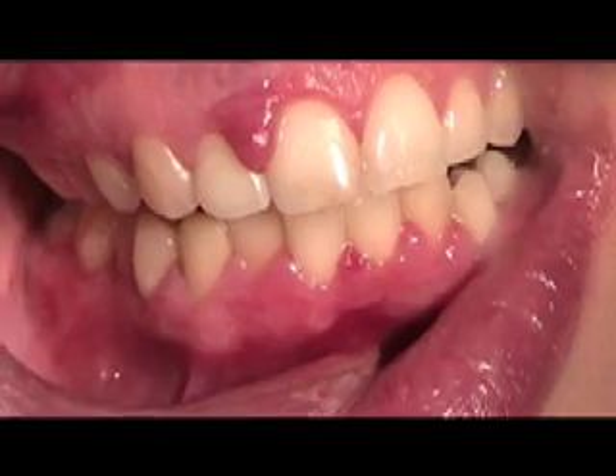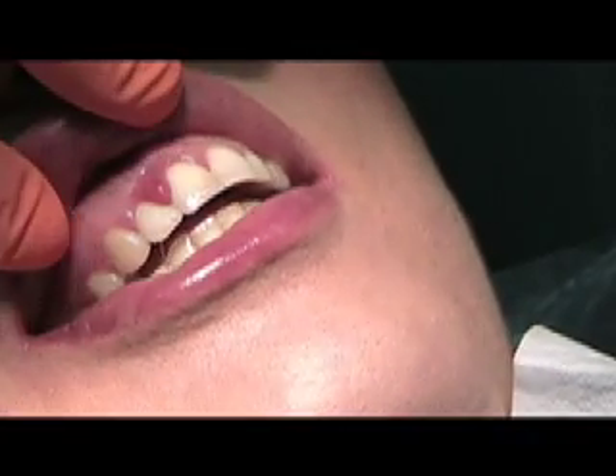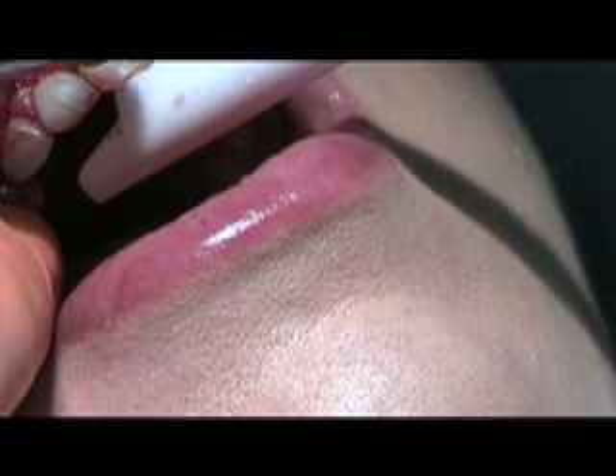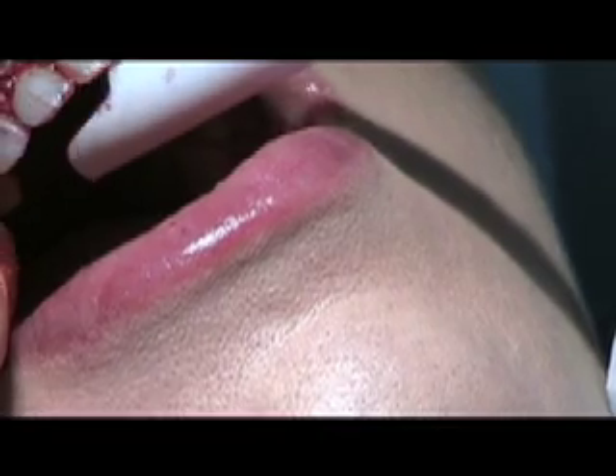Emily's gums have an overreaction to the hormones of pregnancy, resulting in the painful and bleeding enlargement of the gums. The excess tissue was removed and the exposed connective tissue was treated with a laser bandage using the soft tissue mode of the BioLase WaterLase MD dental laser, without the need for any anesthesia.